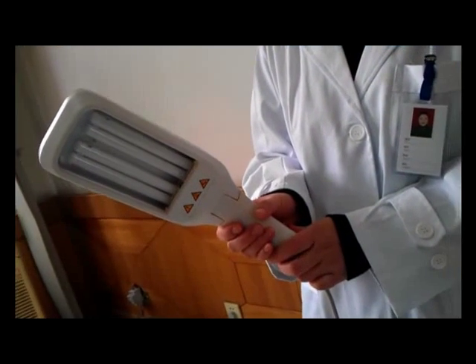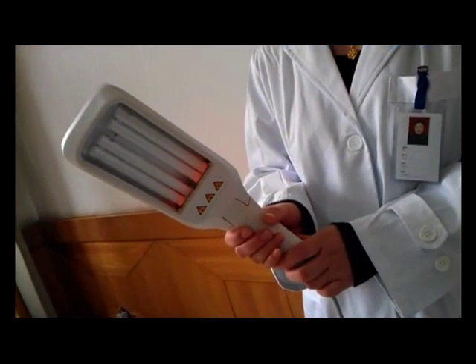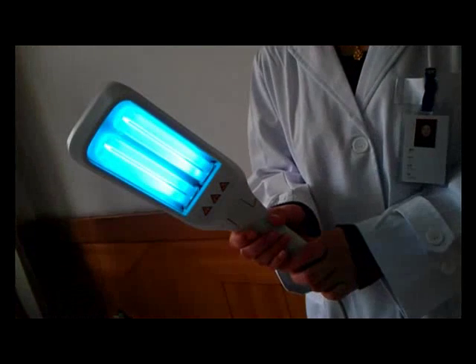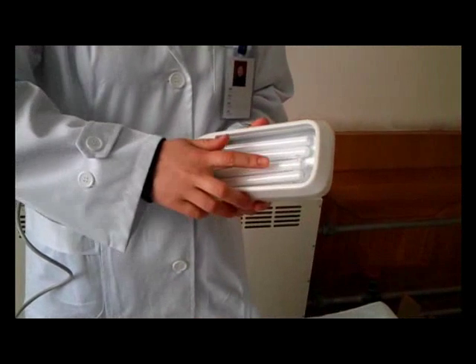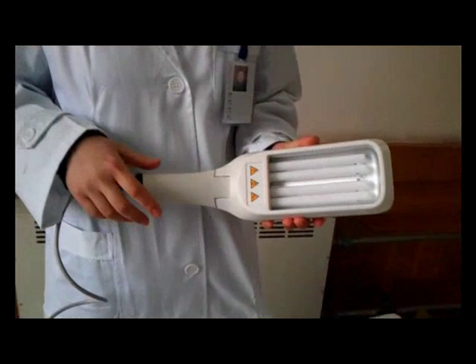When the lamp is on, it starts to perform the treatment. For detailed operation, please refer to the use manual. If the lamp does not turn on, please check whether the lamp is loose.